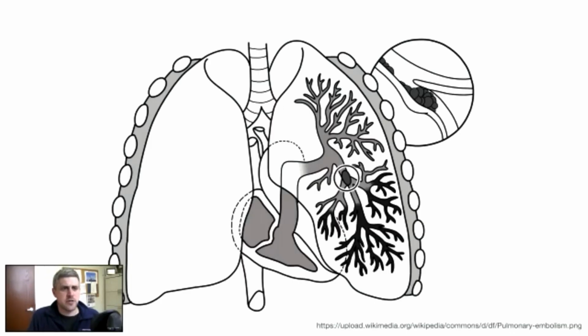As we do that, I'm going to switch over to this screen. Point of care ultrasound for PE, we're going to talk about a few things. I think it's helpful when we get started to think a little bit about the physiology of a pulmonary embolism, and then from there, we can build into how that affects the echocardiographic findings of PE. I'm going to do the big picture, and then Ashish can jump in and talk a little bit about some of the details with the physiology.